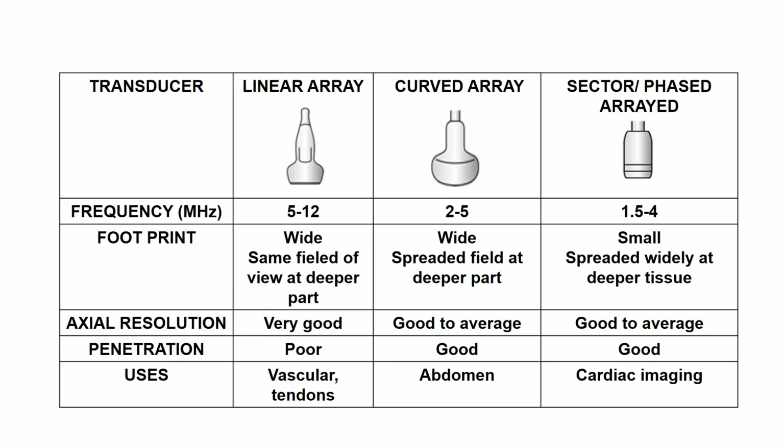Because of that, these linear array transducers are used in vascular sonography and tendon sonography.